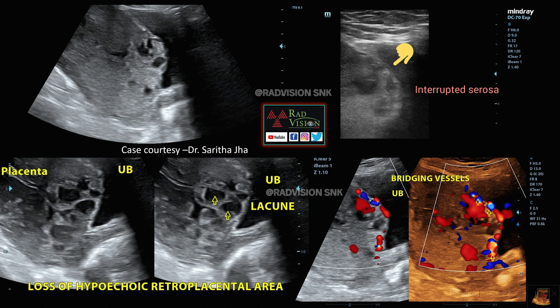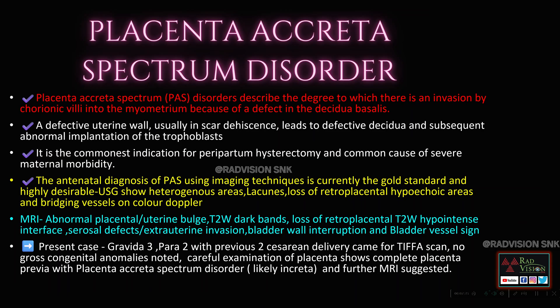Next case, thanks to Sarita Jha for contributing: here you can see the placenta is thickened and heterogeneously thickened, there is an abnormal bulge, there are multiple enlarged placental lacunae, and you can see a defect or interrupted serosa. The placental tissue is seen extending up to the urinary bladder. On color Doppler, you can see multiple bridging vessels and loss of the hypoechoic retroplacental area. This is consistent with placenta accreta spectrum disorder.